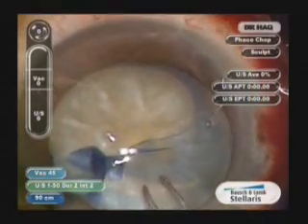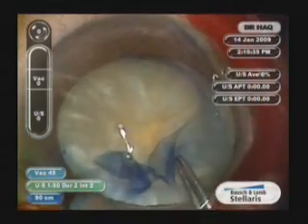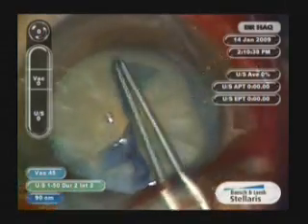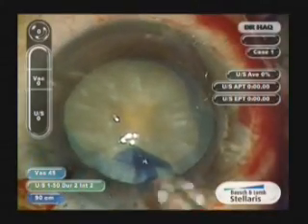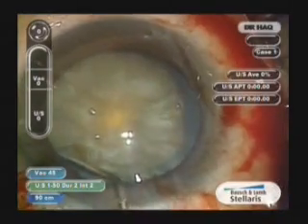Right now that is a little bit far away — grab in a little closer, pull away from the tear, and it comes back in nicely. The rhexis is finished. The nucleus can then be hydro-dissected for phacoemulsification.